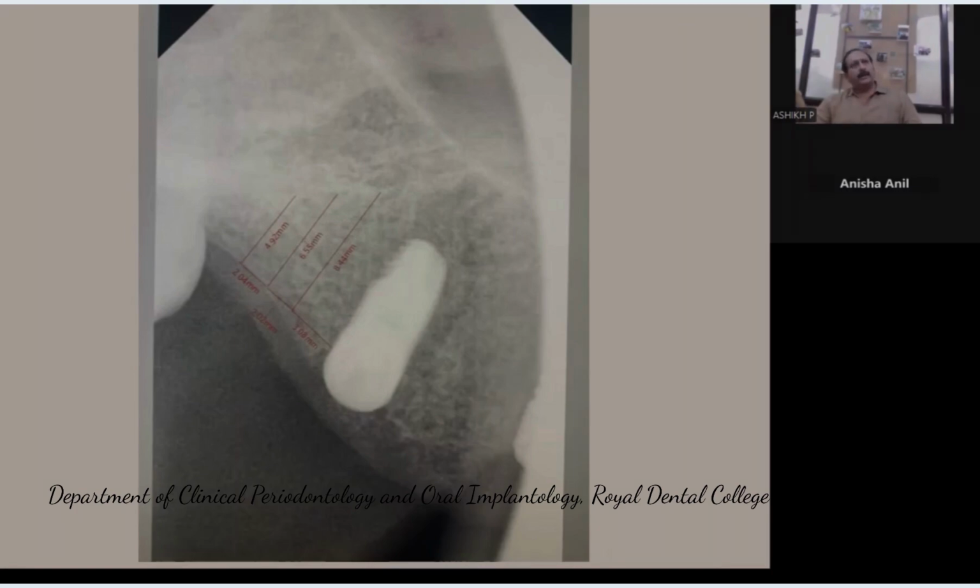If it is yes, then go for it. A longer horizontal incision, so 10 millimeters, with the natural socket area, and then reflect it and confirm the width of the available bone.